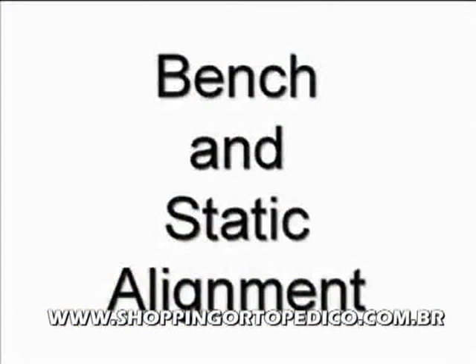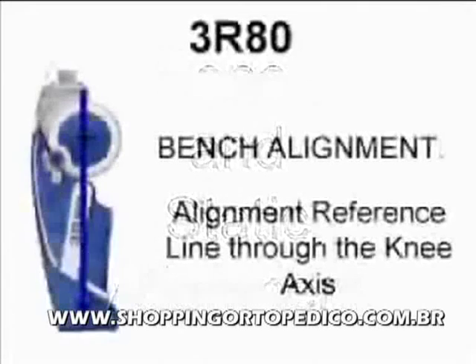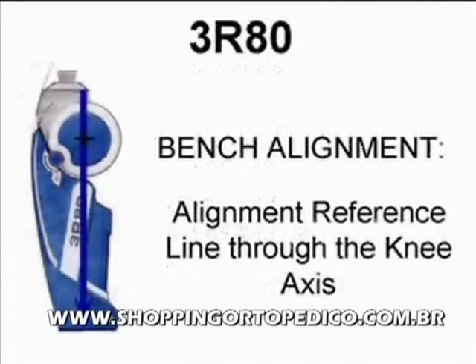Bench alignment is the first step in the fitting process. When the parts are assembled, the alignment reference line should fall directly through the center of the knee axis. Please see the instructions for use for complete details on bench assembly.